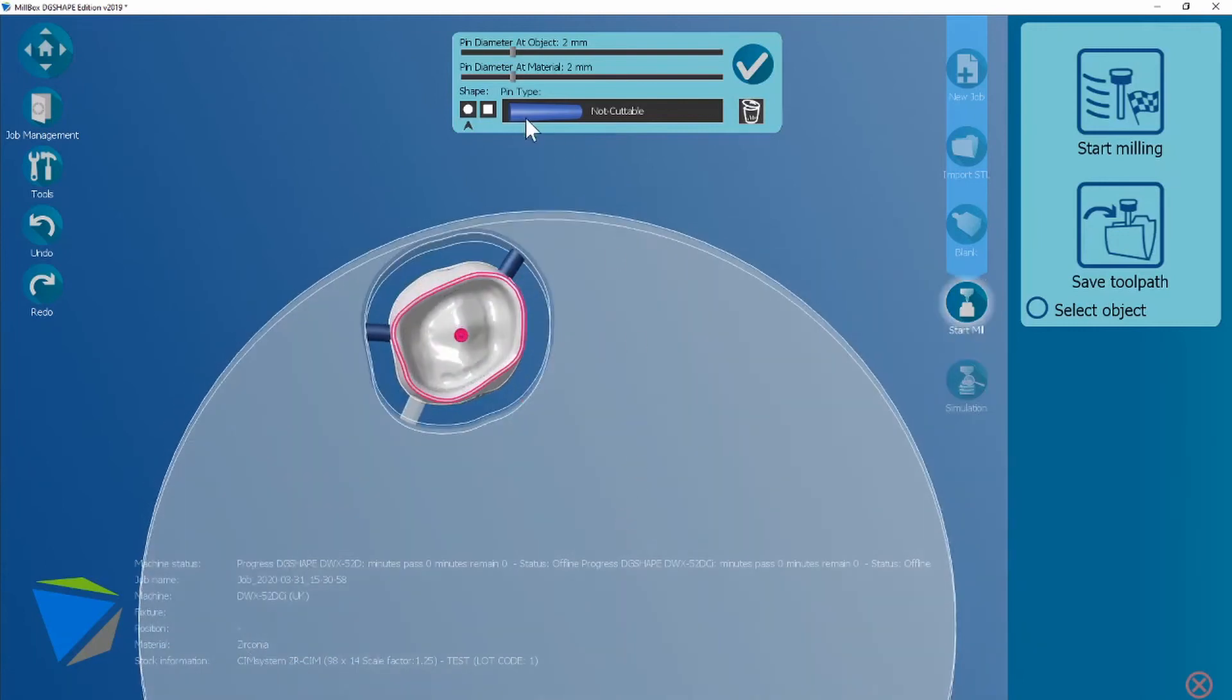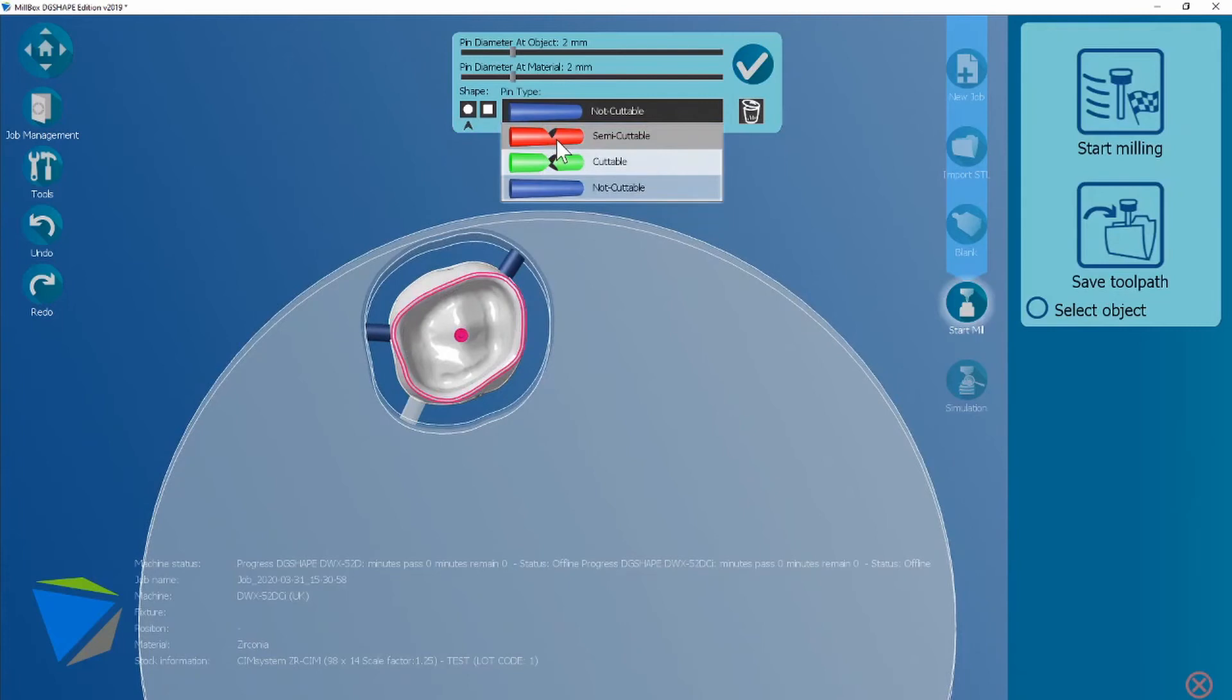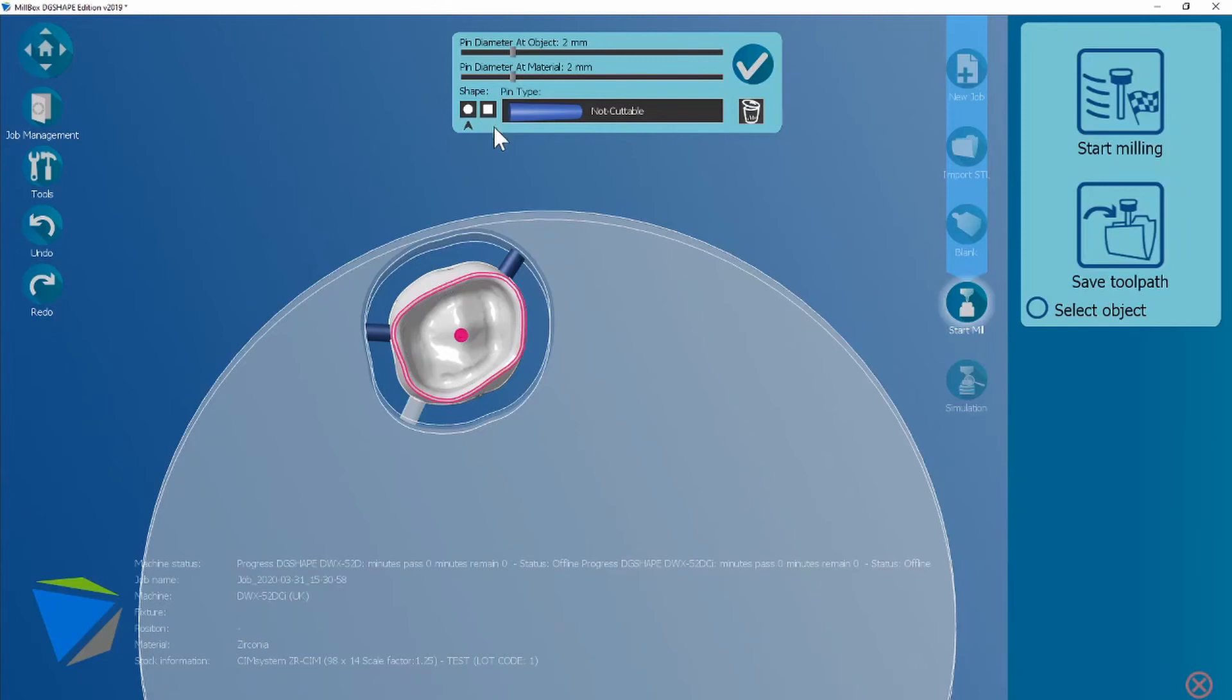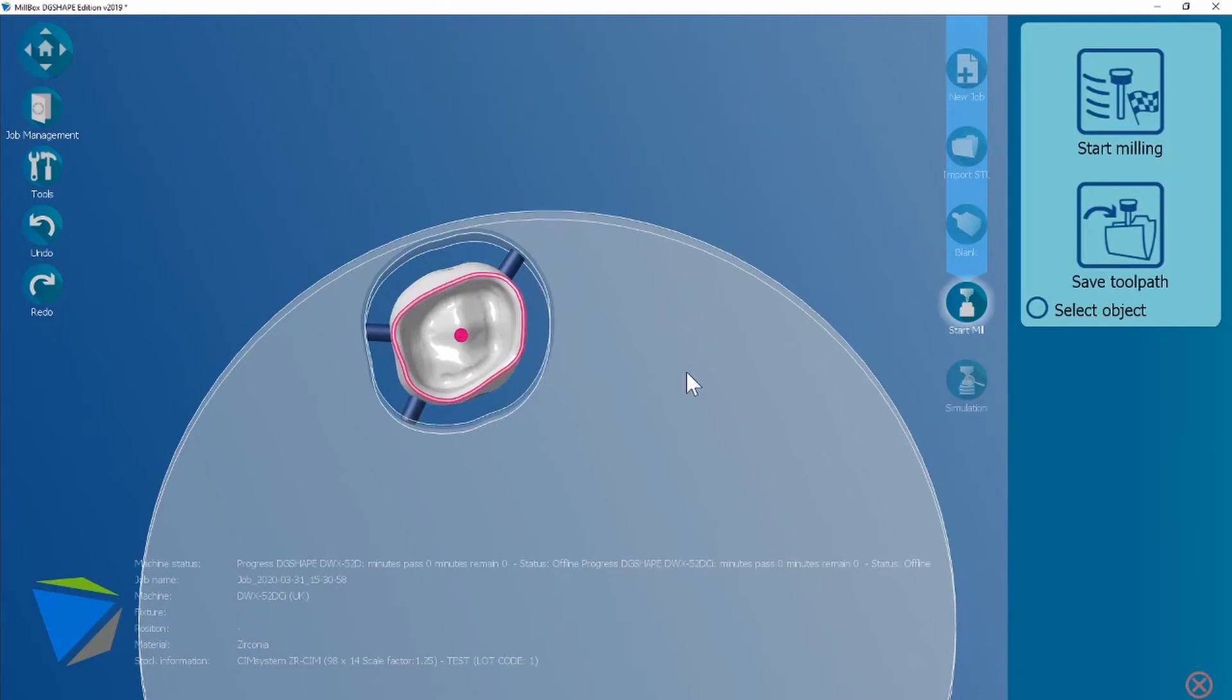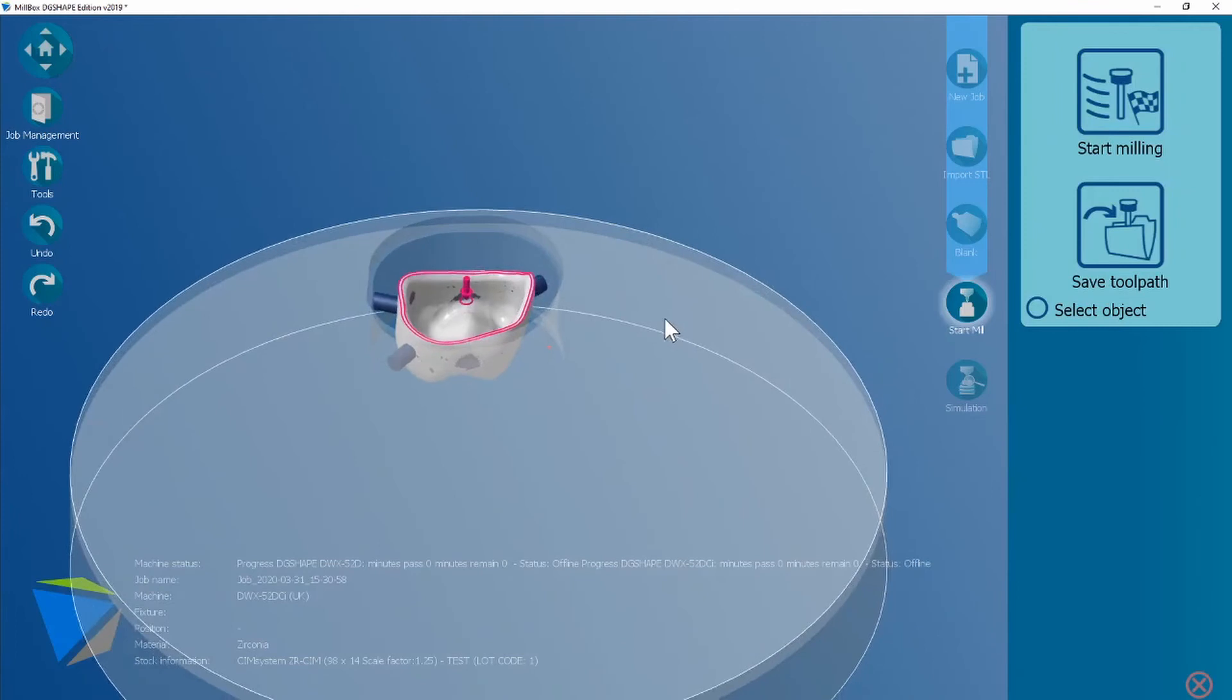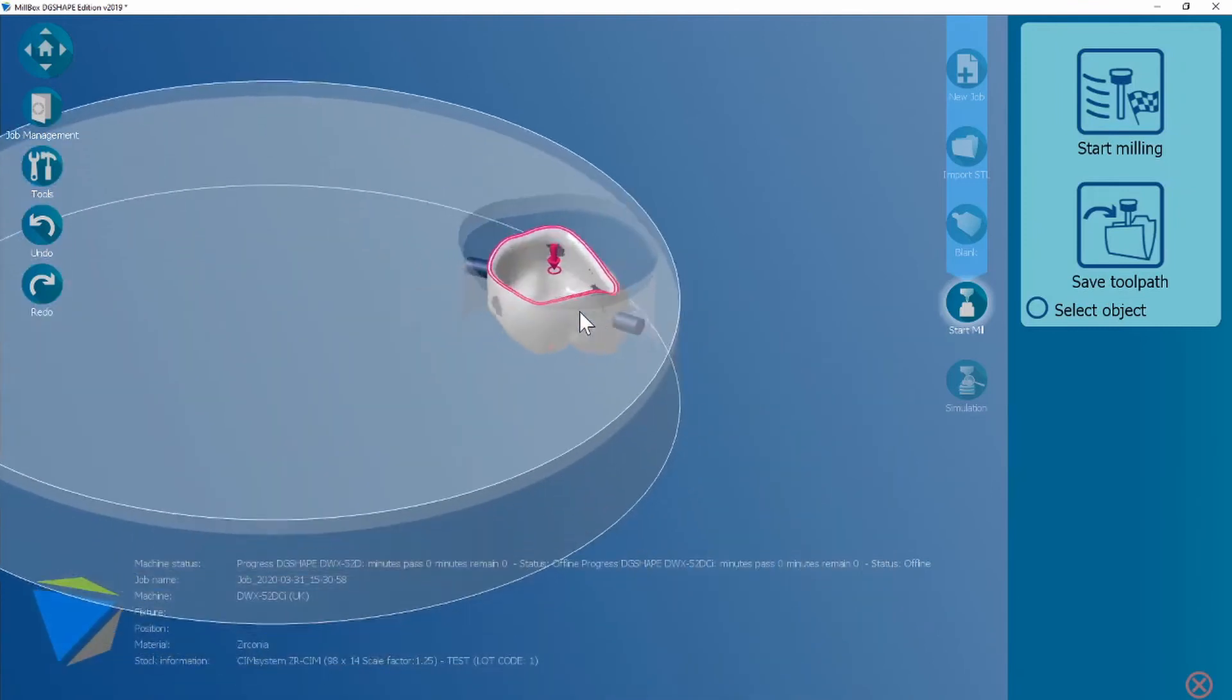Here you can also choose non-cuttable, semi-cuttable or cuttable, the size of the connector and the shape of the connector. Once you're happy you just click in negative space and have a quick check.